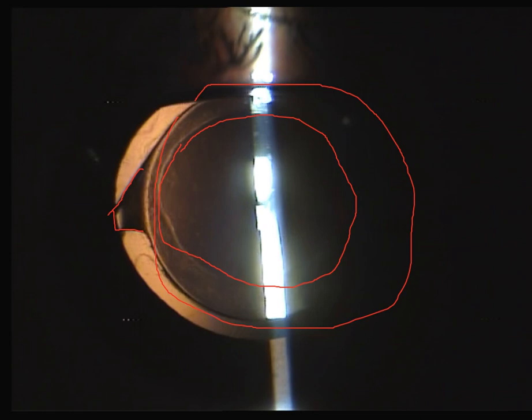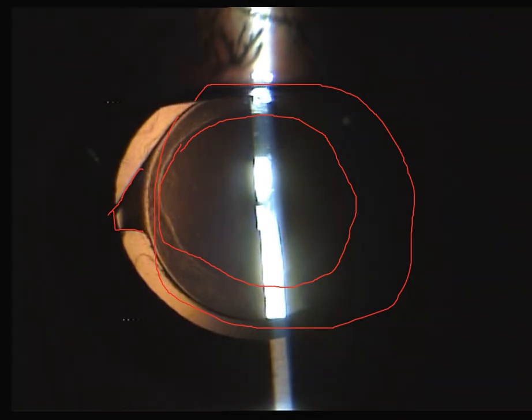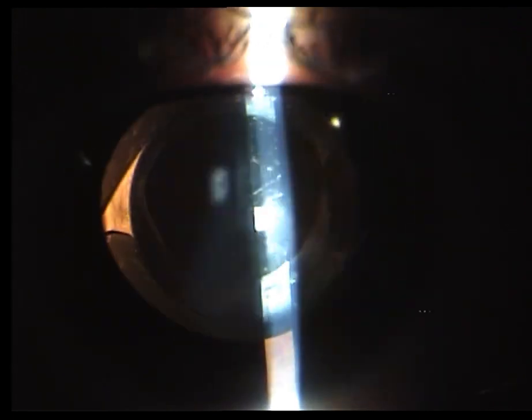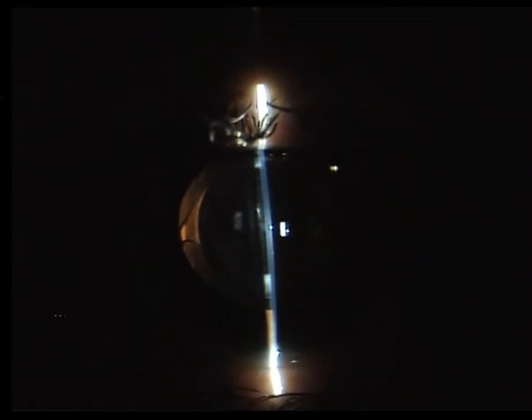In a pseudophakic patient, you also need to identify the site of the incision. Going forward - there is no phimosis, the anterior and posterior surface of the IOL seem to be clear, and there is no posterior capsular thickening.